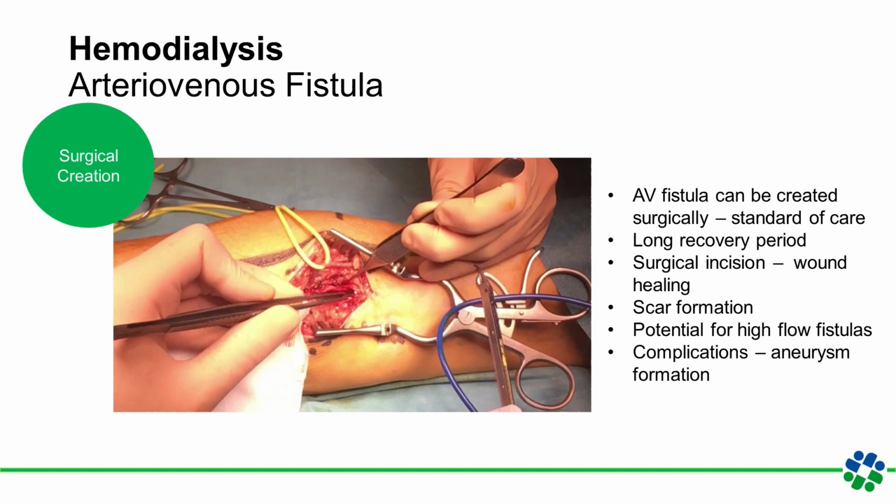Some innovative technologies that are helping to improve surgical fistulas are Sonovex, for example, which offers two key technologies, the EchoMark and the EchoSure, for data collection at dialysis clinics or even a doctor's office to assess an AV fistula or graft's maturation. An EchoMark is an ultrasound marker that helps identify the blood vessels, and the EchoSure automates the detection of flow, diameter, and depth of that access and helps support a physician in identifying an access that is not maturing correctly and needs assistance.